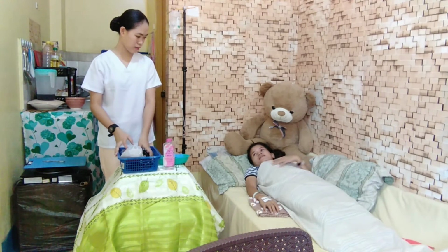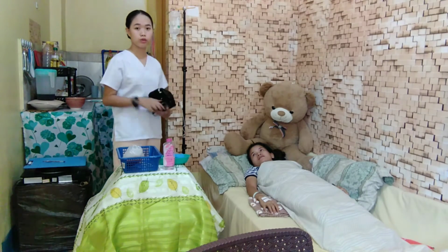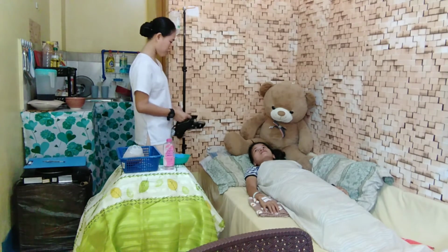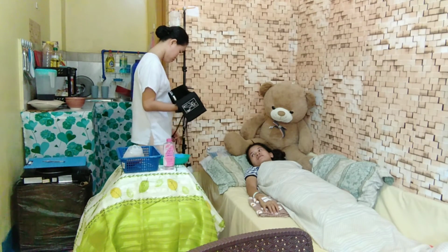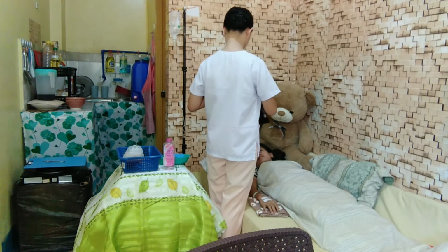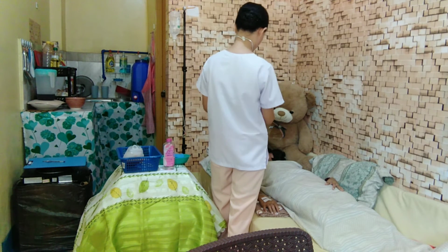By ensuring the privacy of our client, we will close the door and the window and draw the curtain. So, ma'am, I will take your vital signs to have a baseline on you. I will put the cuff on your right arm.